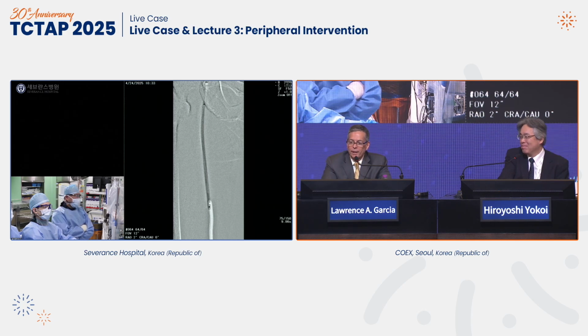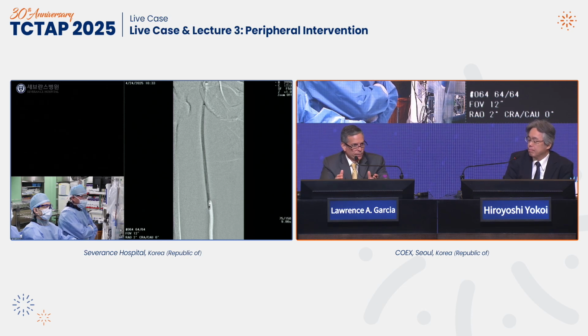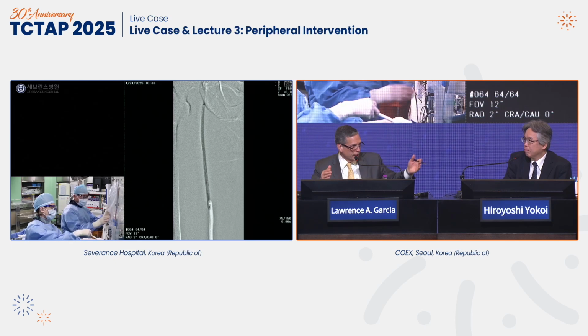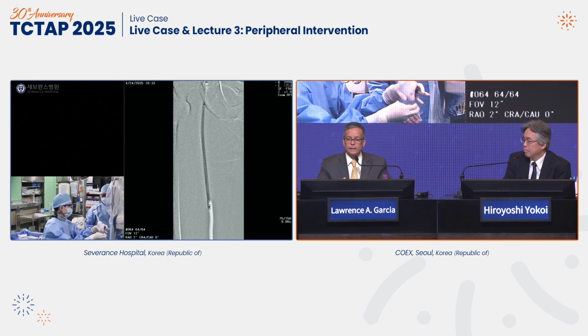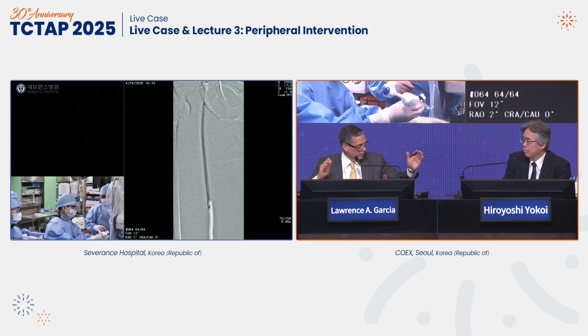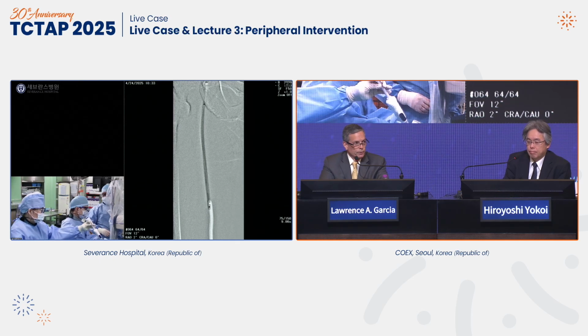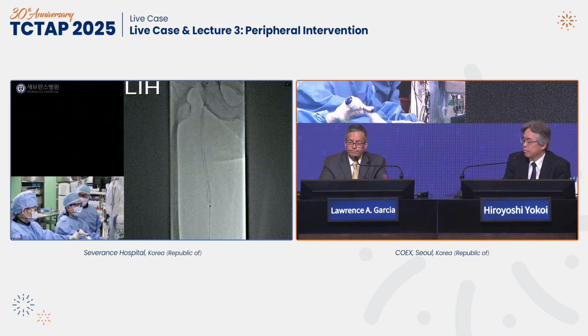I think, Michael, that's such a great point. The challenge is that I don't think that the device companies have heard you, because they still have this very odd length of catheter. So when you extend to 90 centimeters, now you've taken away basically 45 centimeters of your geography that you can get to. That to me is a wonderful idea if they would actually extend and make them longer. Now they've got 200 shafted balloons, sometimes even 300, but it does become a bigger challenge if you don't have that in your lab.